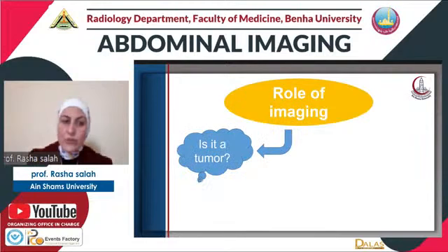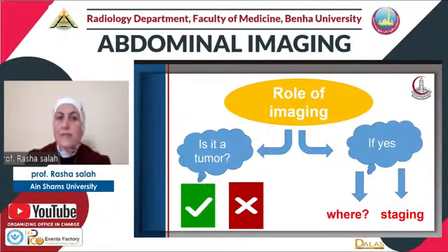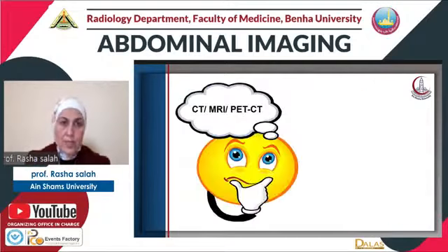MRI is important to identify whether it is a tumor or not, and if it is a tumor, then where the tumor is located and what the proper staging is. These are the questions we are going to answer in our report.